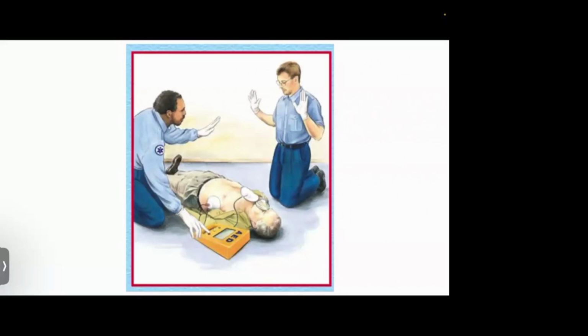You apply it according to the placement which we have already shown, and then you have to say, I am clear, you clear, all clear. Then everybody should be away from the patient, and then you deliver the shock. If by accident you are touching the patient, you yourself might get a shock and an injury from that, so that is definitely not recommended. That is how you're supposed to do it. This picture clearly demonstrates how you're supposed to deal with such shocks.